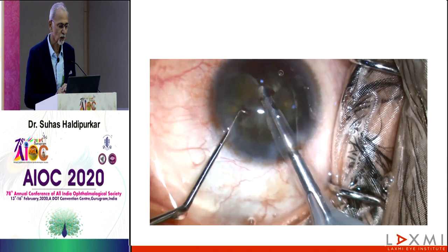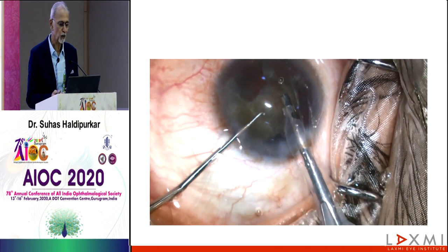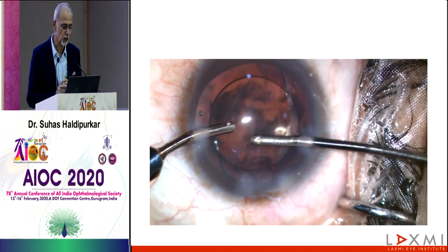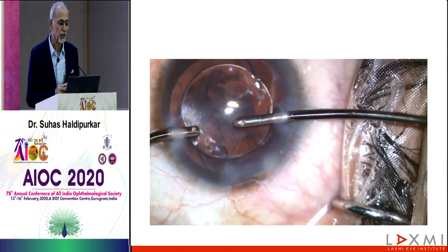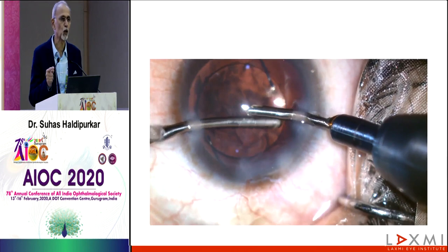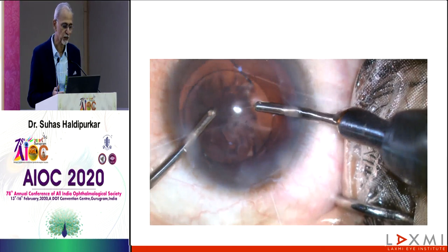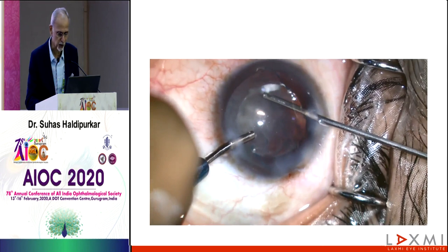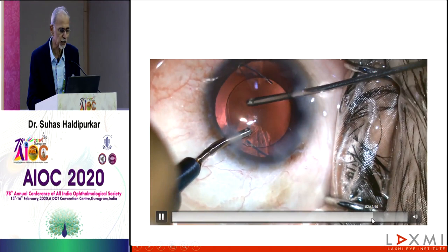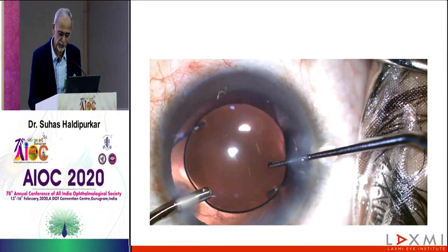And then it's just a matter of routine, because it's not a hard nucleus. And once you have done with that, based on how much vitreous is disturbed and how much cortex is behind, you decide whether you want to go pars plana or from anterior. But one thing one should remember is that doing vitrectomy from the anterior approach is not causing more disturbance to the vitreous which we have already caused. And a little bit of vitrectomy, one after another, can definitely help you come out of this. And finally, to cut the time, you reach a stage where practically most of your cortex is out, and the lens is well centered, and that's it.